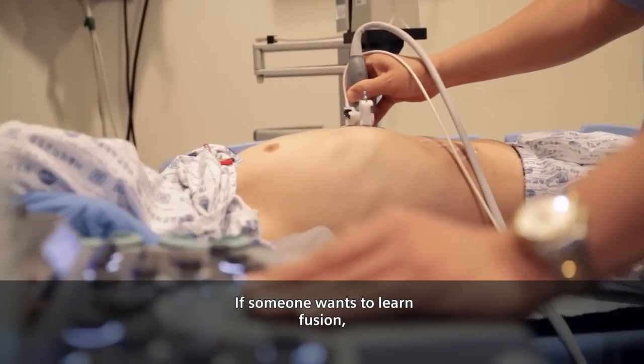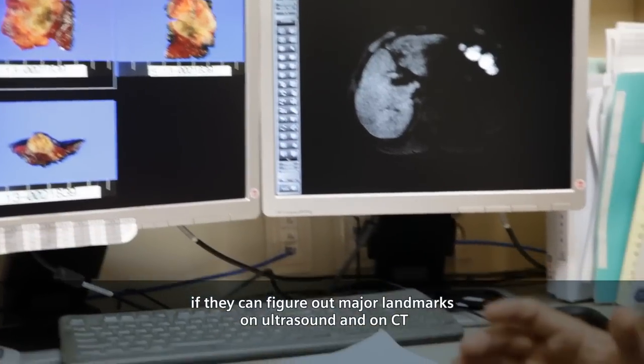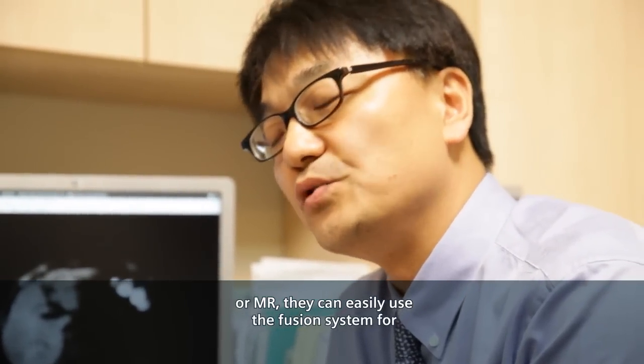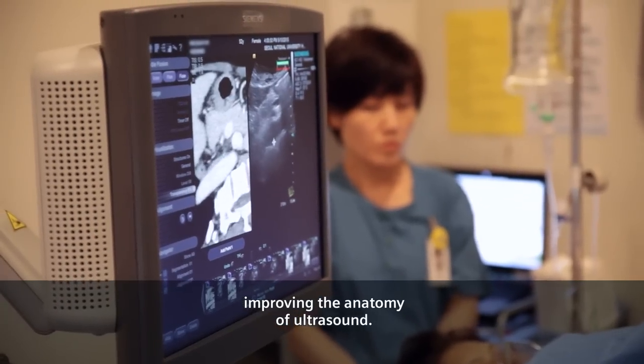If someone wants to learn fusion, if they can figure out the major landmarks on ultrasound and on CT or on MR, they can easily use the fusion system for improving the anatomy of ultrasound.